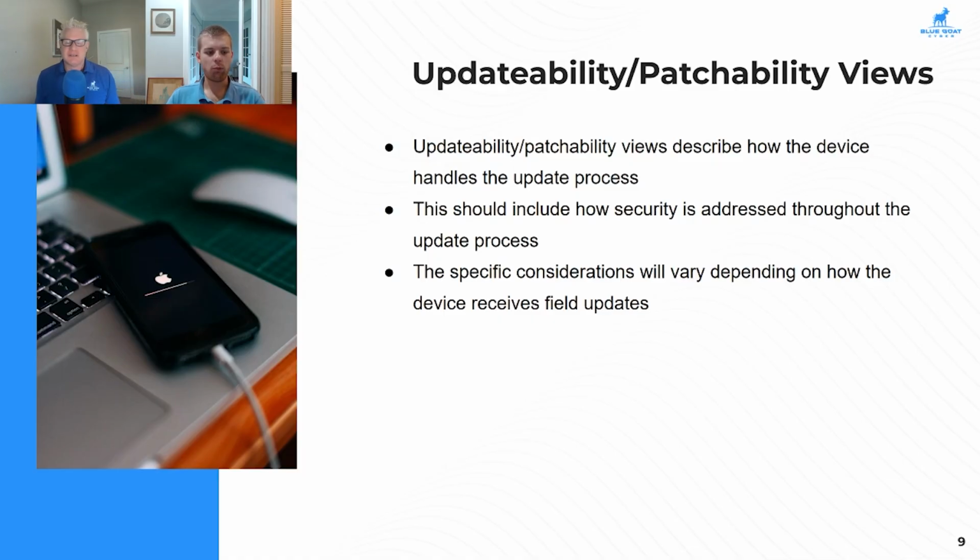Exactly. So with all of the components that'll tie into the update and patchability process, what the FDA is trying to do, and they are encouraging that devices have update functionality. It's highly, highly encouraged, even though update infrastructure and update functionality can introduce their own level of risk. But the ability to remove risks in the device through over-the-air updates is often a greater benefit than the drawbacks of having the potential risk through compromise of that update infrastructure.